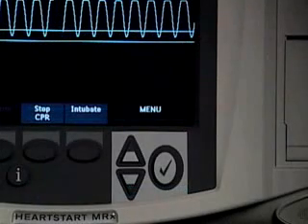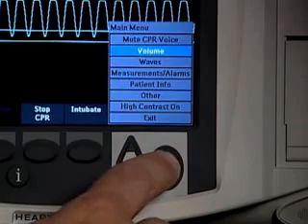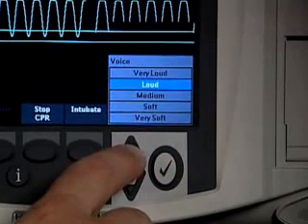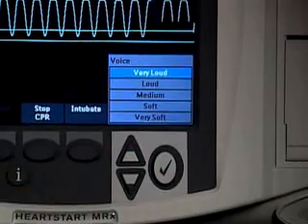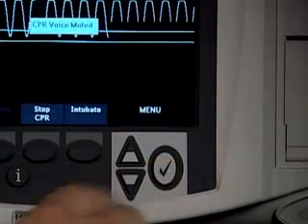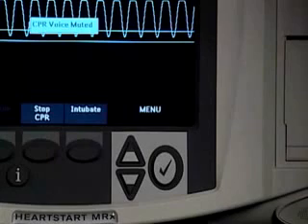The volume of the QCPR voice prompts can be adjusted either up or down using the main menu of the MRX. Going to Volume, Voice. If needed, begin CPR. The QCPR voice prompts can be muted with 2 presses of the menu button. When they've been muted, there's an indication on the screen. The voice prompts can then be reactivated with 2 more presses of the button.